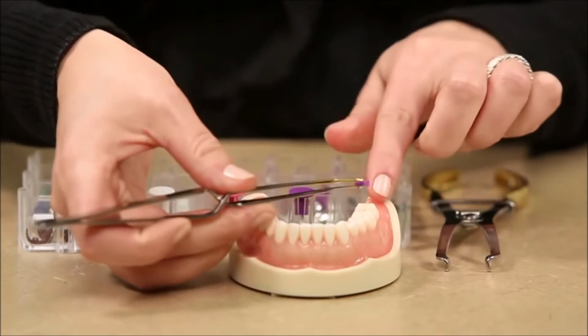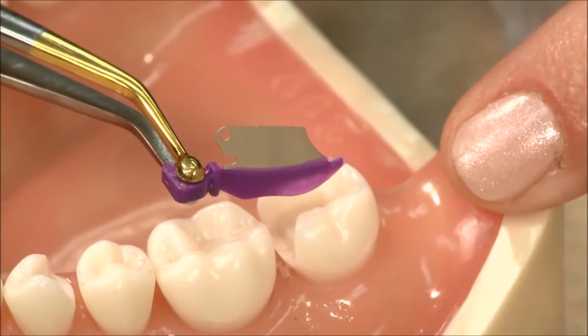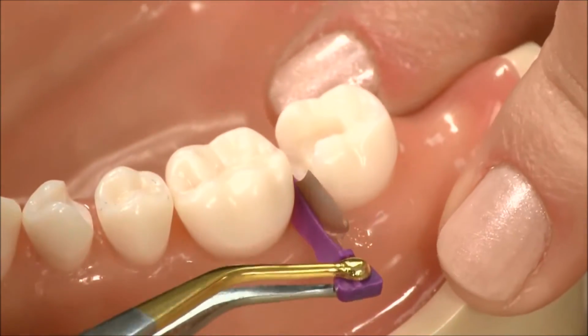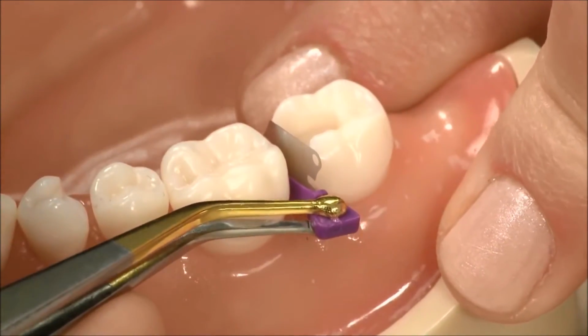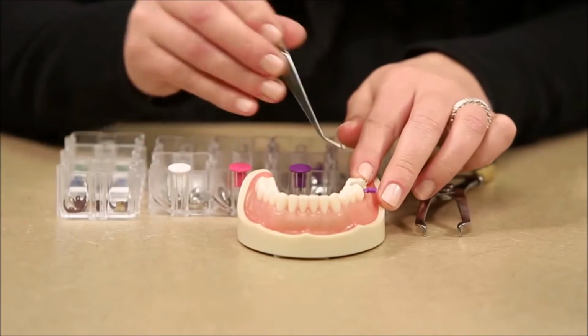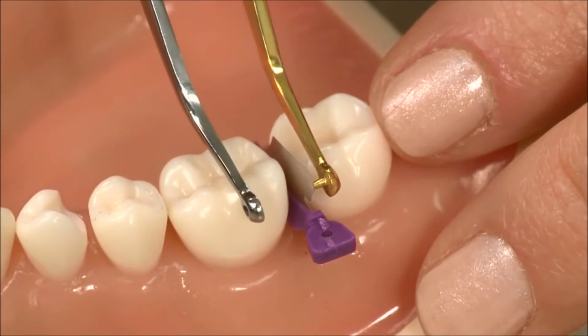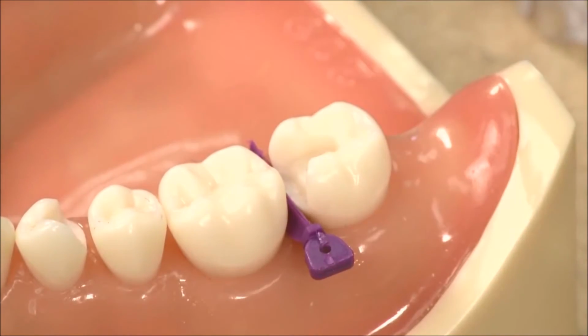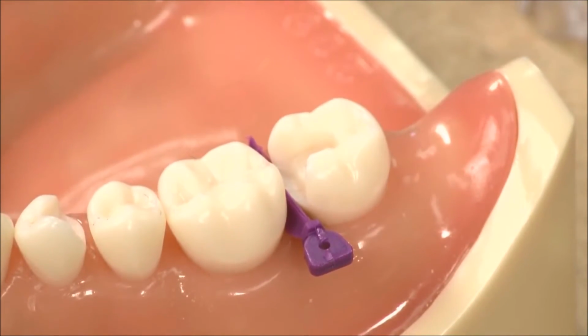This is going to protect the adjacent tooth when you're doing a cavity prep. So you'll place the wedge guard in before you do the preparation, and then as soon as you're done, you'll actually place the pin tweezer in this little hole and remove the guard. And then the wedge will stay in place for the restoration.